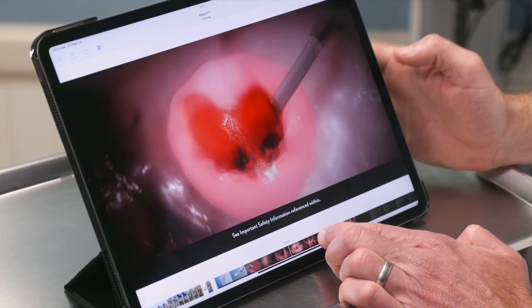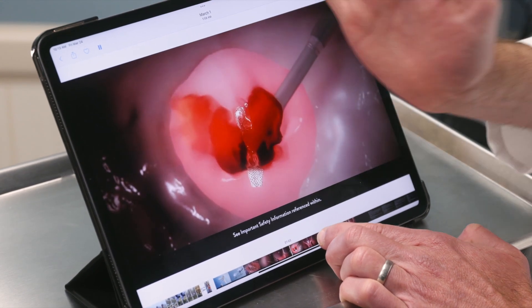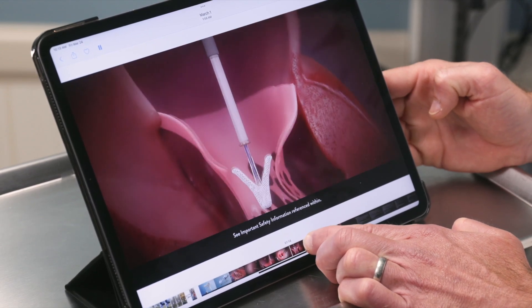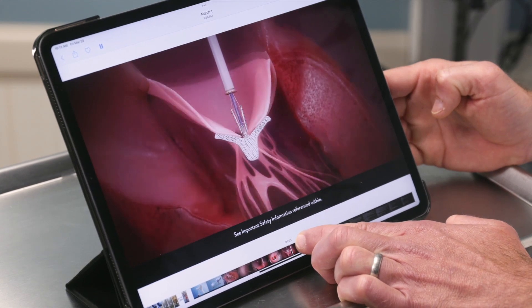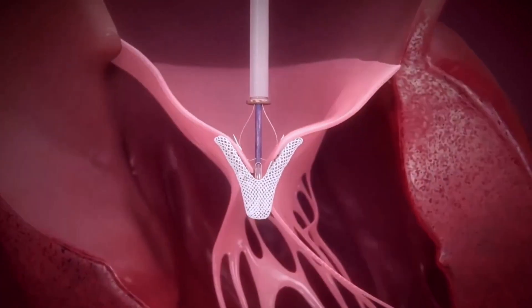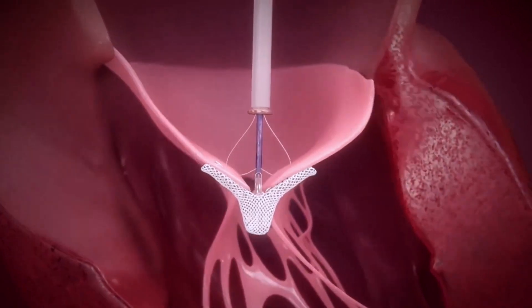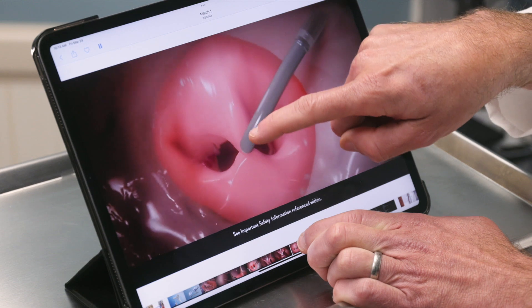We maneuver the device and get it lined up so that it's perpendicular to the valve. We can do that on 3D imaging, then go underneath the valve — and this shows how we grasp the two leaflets together. The top elements come down, we close the clip, and we get rid of the area in the middle that was leaking.